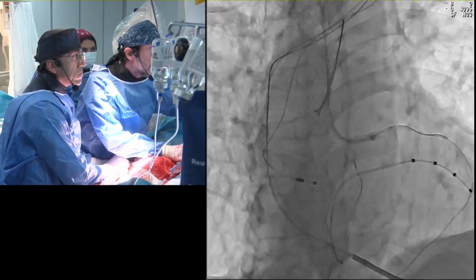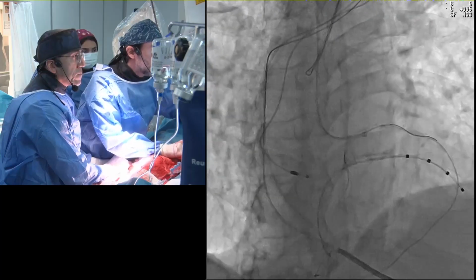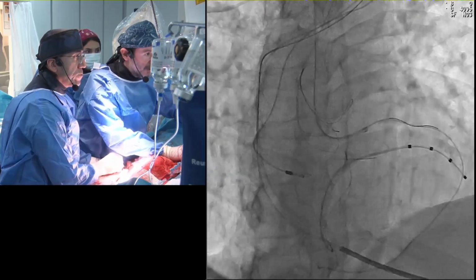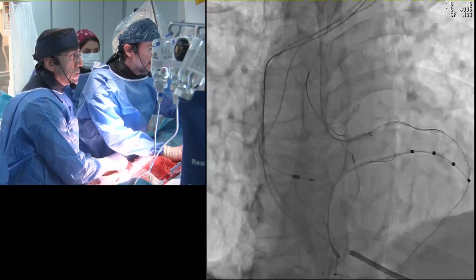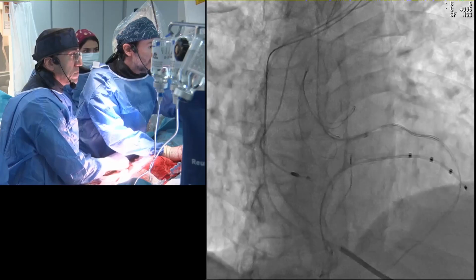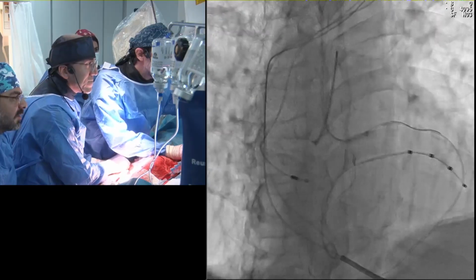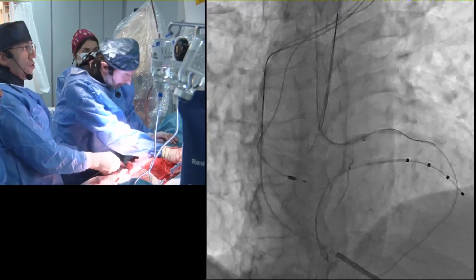Yeah, okay. Now try to capture it. So I will change with the R350. The other thing you can do is push the wire all the way to the descending aorta and capture it there. Yeah, this is another option I'm thinking of, but as I said, we have too much friction here. I know, it's difficult. I will change with the R350. I will take that advice. And the other option is to come back with the microcatheter. I have got it. Yeah, I have got it.